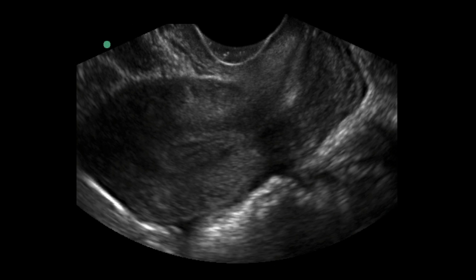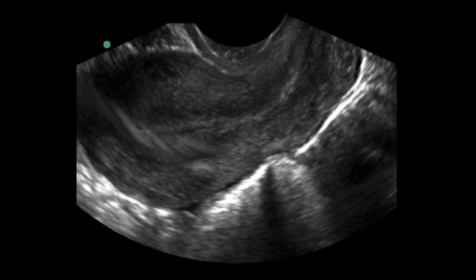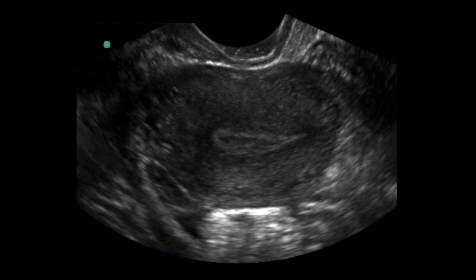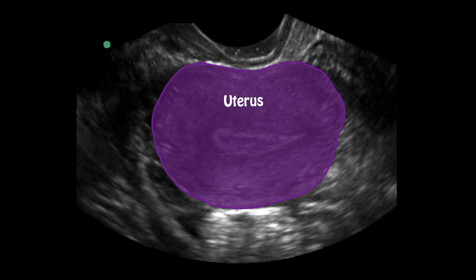With the endometrial stripe visible right down the middle of the uterus, we fan through from the fundus and focus on what's inside the uterus and any surrounding anatomy outside that may be pathological. Often during a transvaginal ultrasound we cannot see the entire uterus and cervix in one view because we're so close to it, so we angle down to get the cervix and fan through to make sure there are no structures there. To move to a transverse view we rotate the probe marker towards the patient's right — about 12 o'clock to 9 o'clock — and again see the endometrial stripe in the middle, looking for any signs of pregnancy.